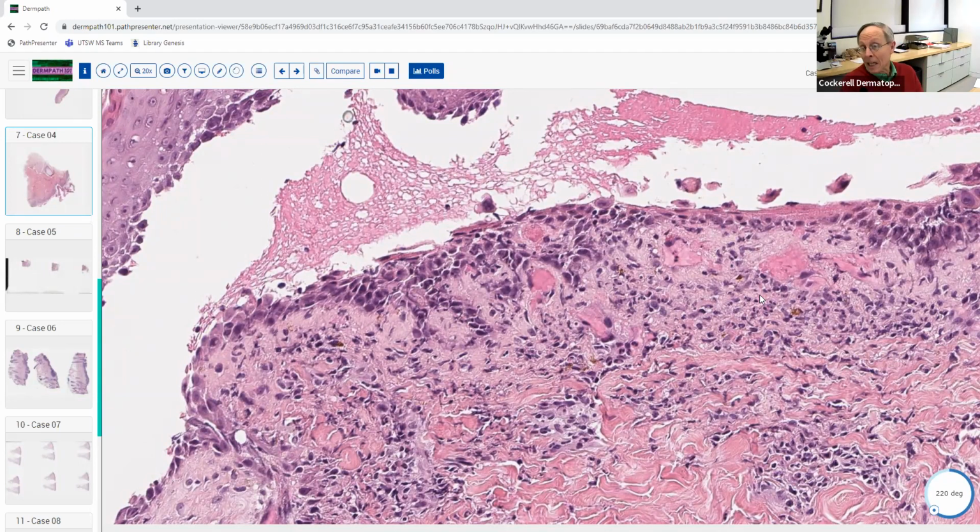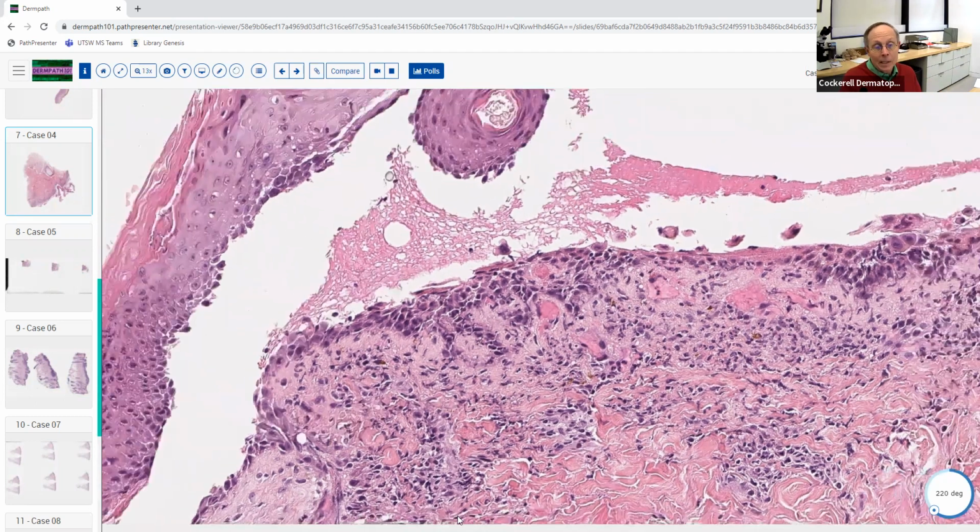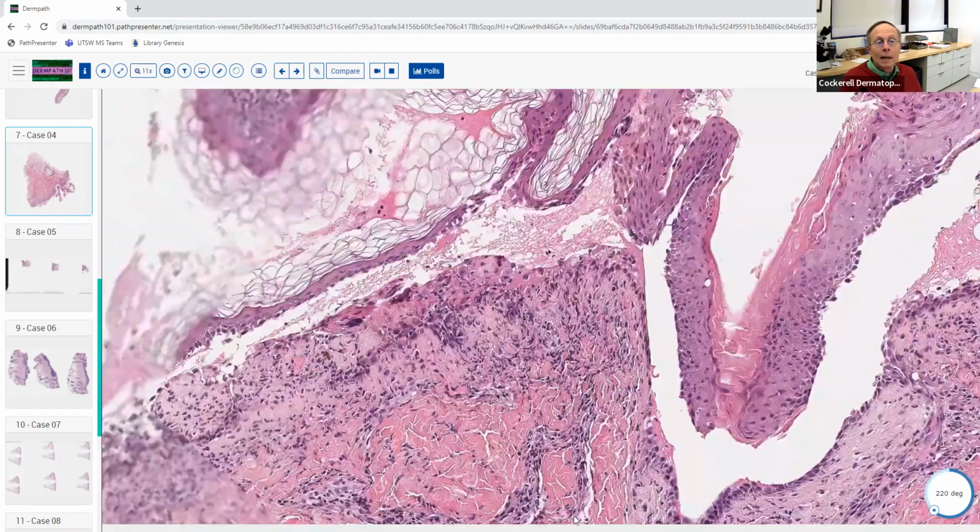But actually it'd be more of a later stage, where you get a blister and then it reepithelializes. Then you biopsy it and you see the blister roof floating up there, and you see this reepithelialized epithelium beneath it, and you say, oh, it's got to be an intraepidermal blister. Well, no, actually, we see bullous pemphigoid, EBA, linear IgA, all these kinds of things. If you biopsy relatively late, it may reepithelialize underneath, and then you can be fooled. So just remember that's a way you can be fooled. That's not happening here. You're totally correct.